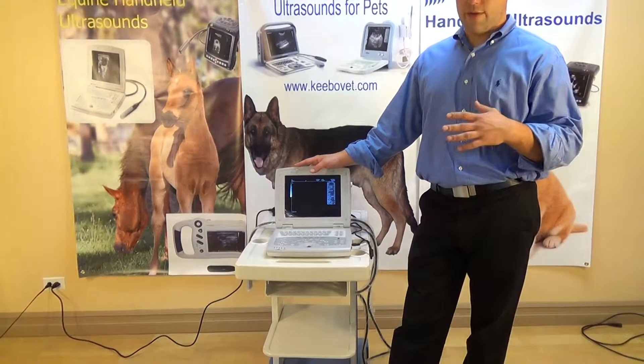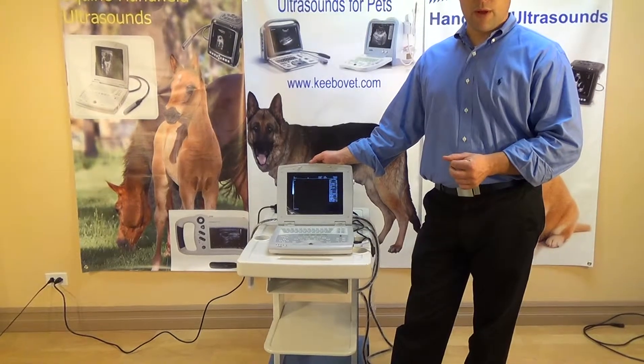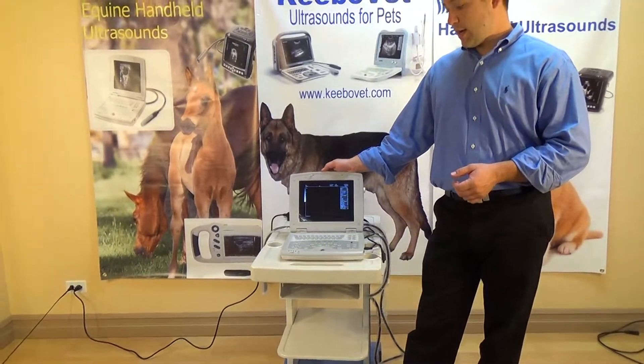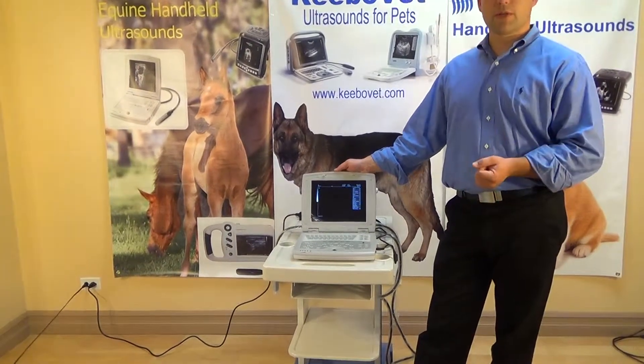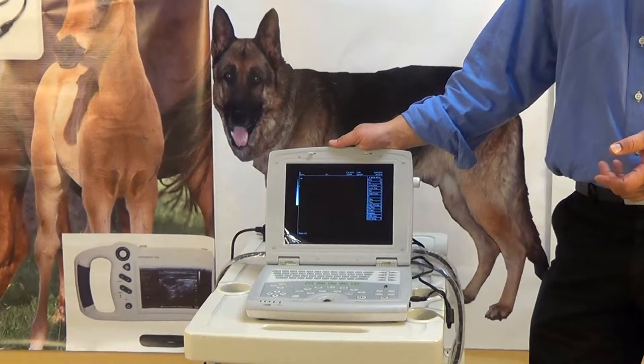You can have a variety of probes depending on your needs. It comes with a rectal probe that goes from 5.5 to 7.5 MHz. If you're doing large animals, that's perfect. But if you need a different probe, we can arrange something — just let us know what you need.